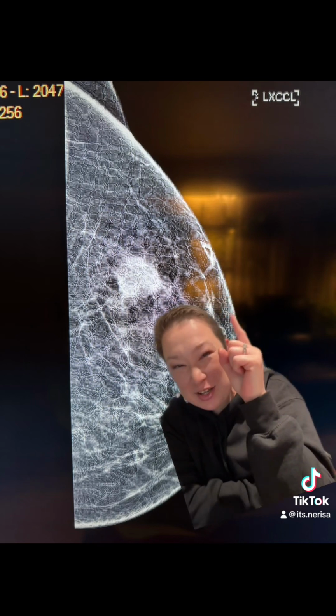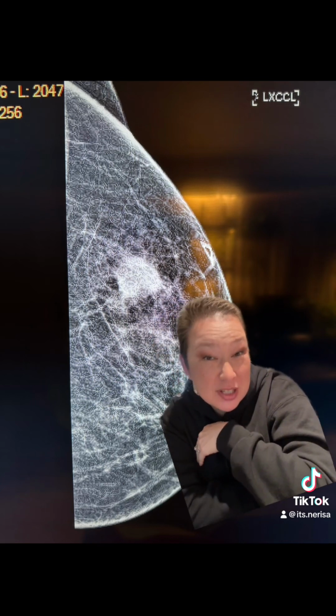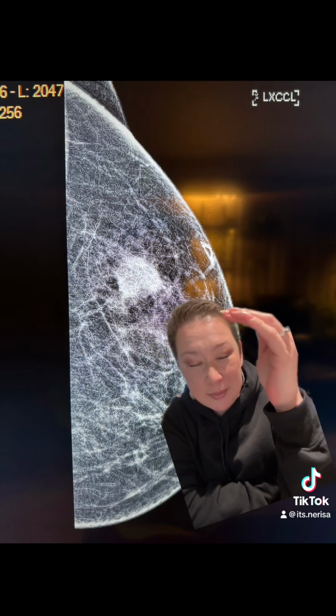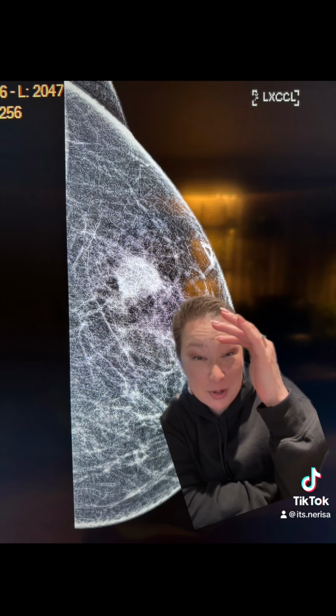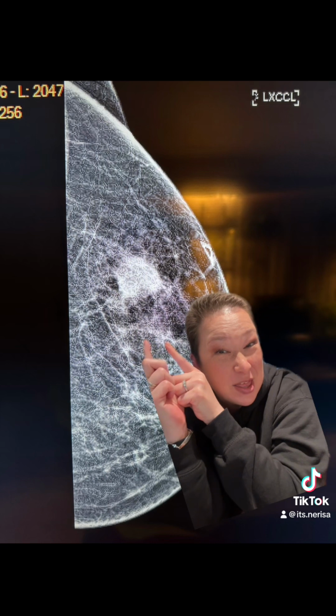Okay, December 7th, 2022, my very first mammogram ever. Because I had a palpable lump, a lump that I could feel, this was not just a routine mammogram, this was a diagnostic mammogram. And so they put this special sticker on there, that triangle bit, and that helped them pinpoint where my lump was before we knew it was cancer, in case it didn't show up very well on the mammogram. But surprise, surprise, that white blob right there, that bastard, is what we now know is my cancer.